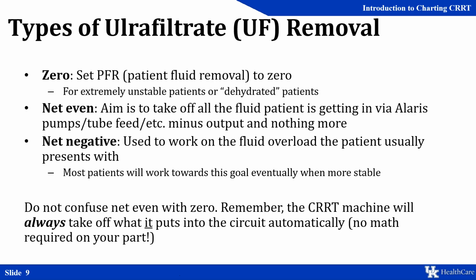There are 3 ways that we may write a prescription for ultrafiltrate removal at UK Healthcare. The first one is a PFR of 0. This means that the machine will strictly only clean the patient's blood and not pull any net fluid. This can be reserved for extremely unstable patients or quote-unquote dehydrated patients. When we say dehydrated, we don't mean a patient that maybe came in with a pre-renal acute kidney injury from camping because they were dehydrated.